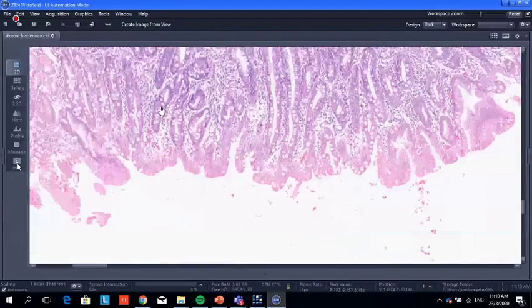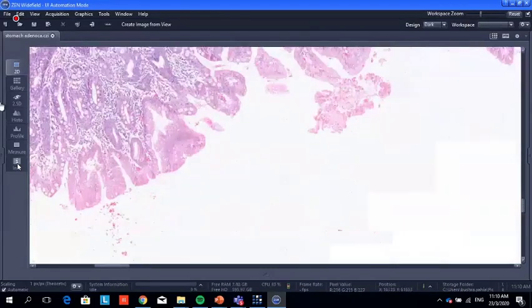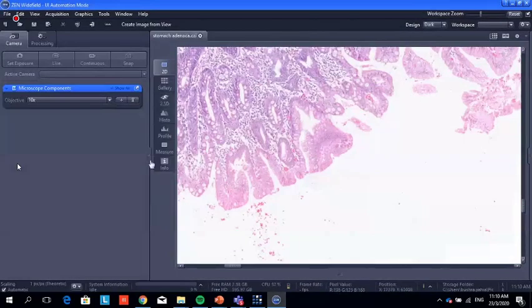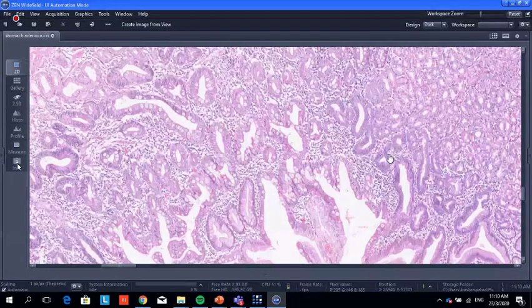This patient has H. pylori and got gastritis. With a long time, it causes metaplasia, then dysplasia, then transformation of the glands into malignant glands.